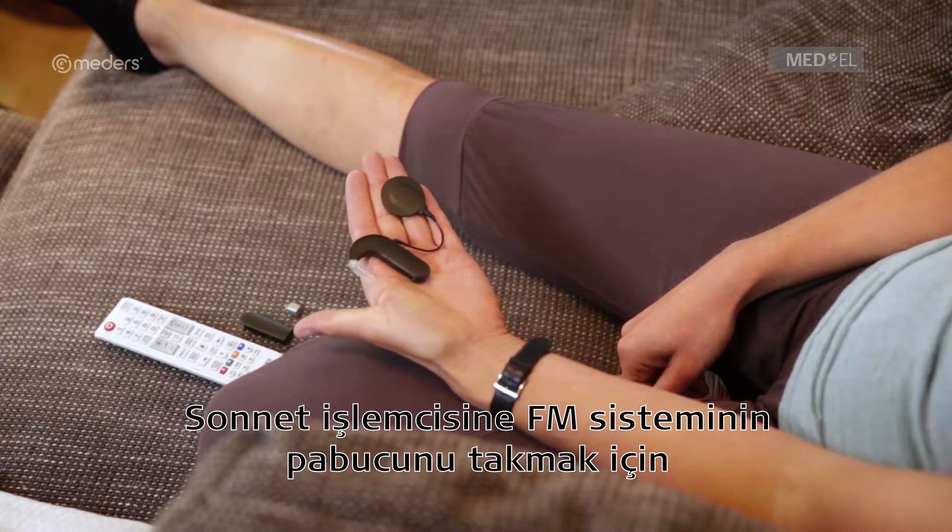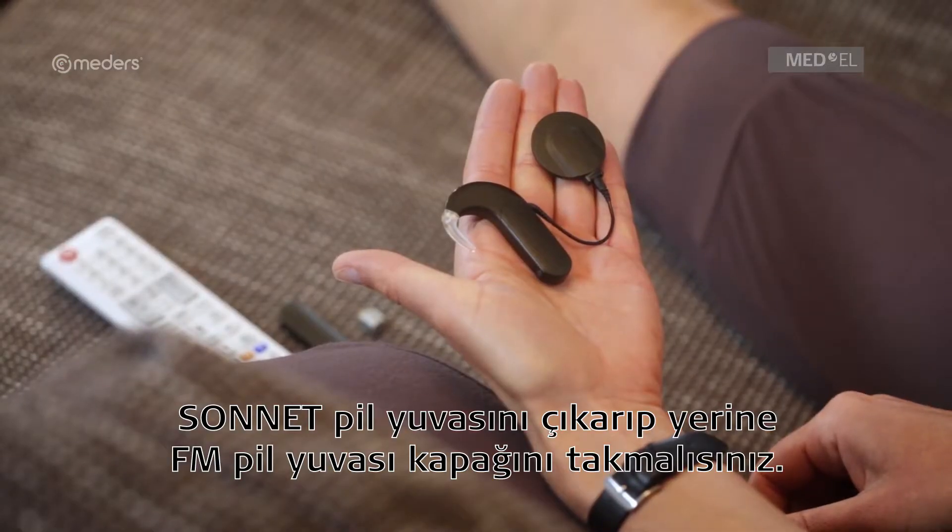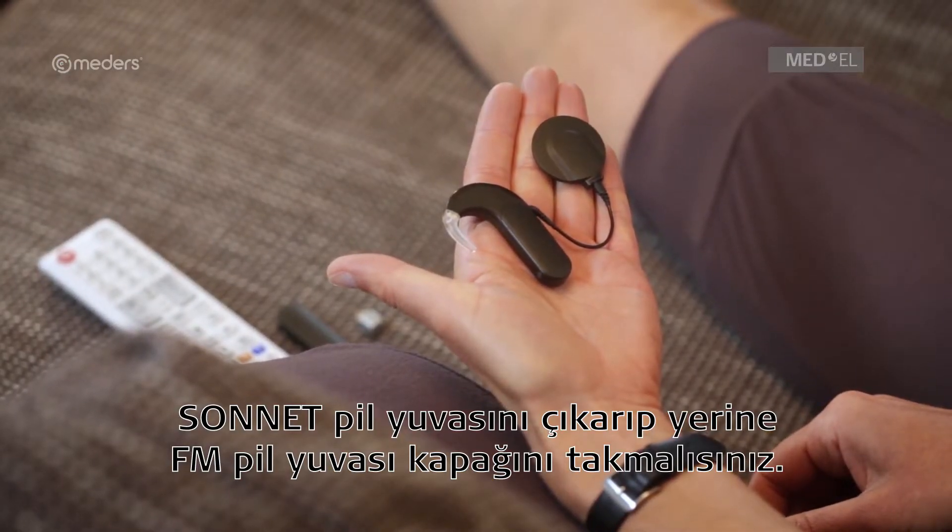To connect to third-party FM accessories, you'll need to replace the Sonnet battery pack cover with the Sonnet FM battery pack cover.